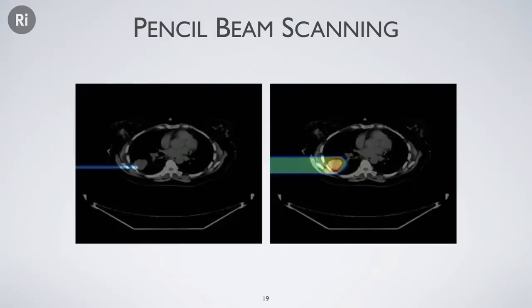You can see as we bring that beam in that none of that dose gets deposited just beyond the tumor. At least that's the ideal. On that picture, right in the center, that's the heart. You've got the heart and the spinal cord. So you're avoiding depositing dose into the heart and the spinal cord, in some cases, of a growing child. Which is why we try and use proton beam therapy more often in children, because you then spare growing organs.